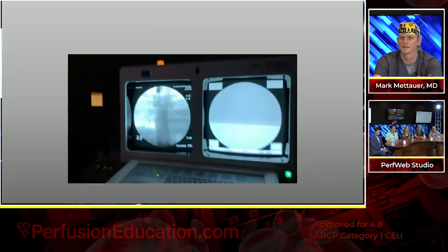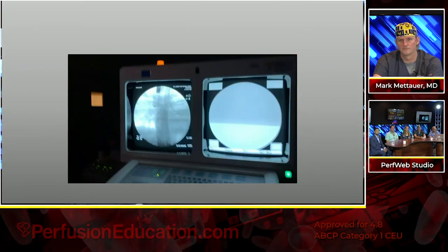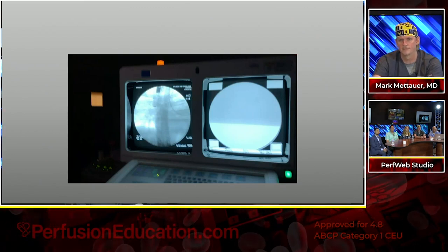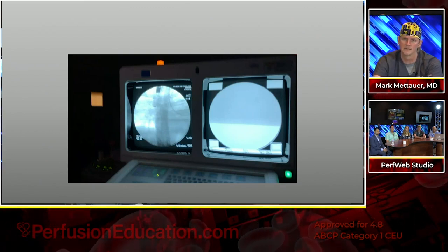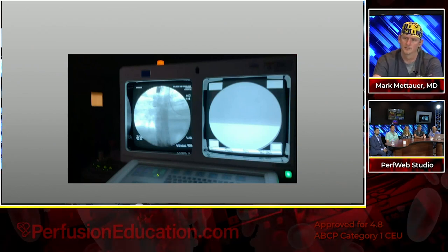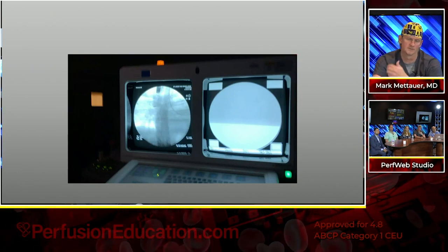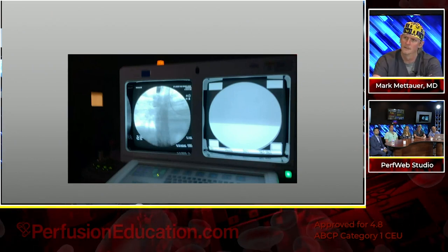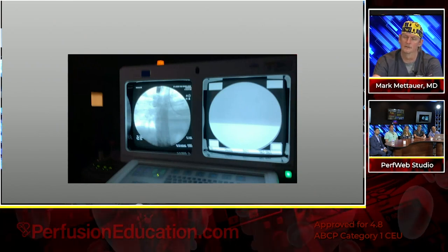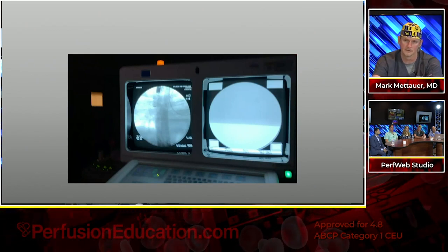So next slide. So this is in preparation for placing the angiovac. You have to have fluoroscopy. You can see the TEE probe already down. He's prepped out just like you would say for an isolated aortic valve or mitral valve, except you got to expose the neck a little bit because that's going to be your inflow cannula to the ECMO circuit. Basically, it's an ECMO circuit, and that's the way we prepare it.